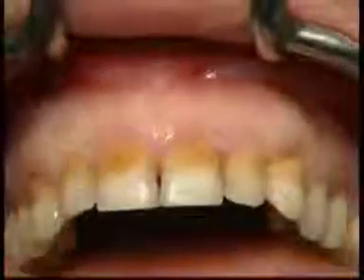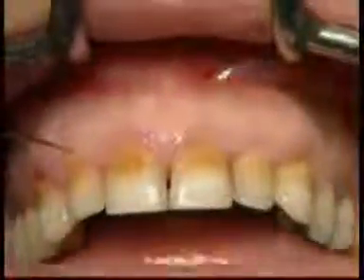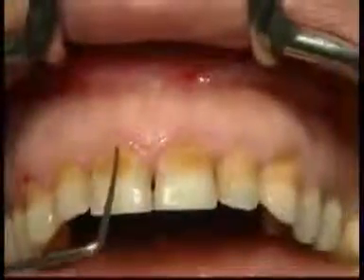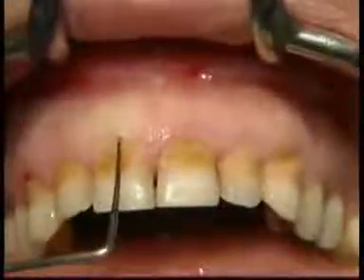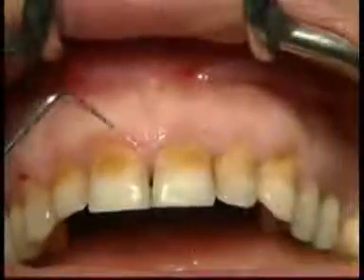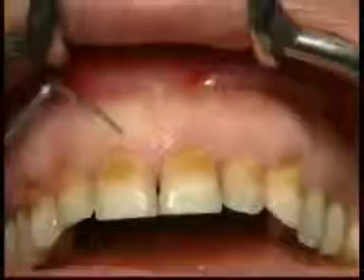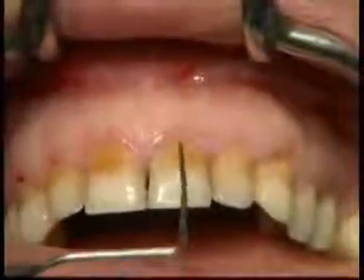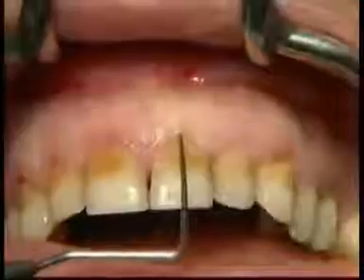The external bevel gingivectomy is usually preferred to the internal one when there are natural teeth and pseudopockets and compact fibrous tissues are present. Using a periodontal probe, a measurement is made to evaluate the depth of the pseudopockets, and taking measurements on the vestibular aspect, a puncture is made using the probe in order to have a small drop of blood which indicates the depth of the pseudopockets.